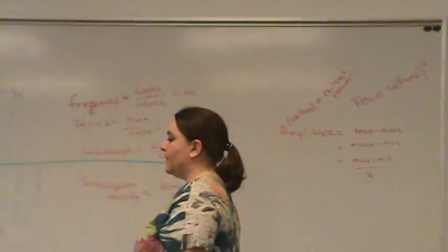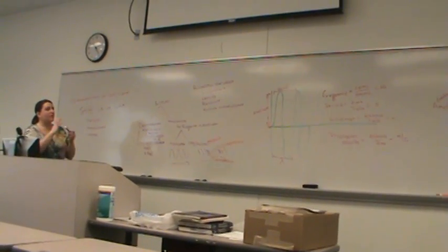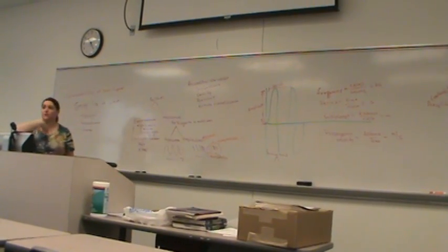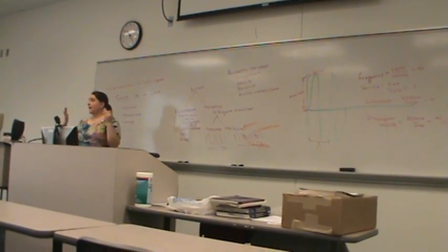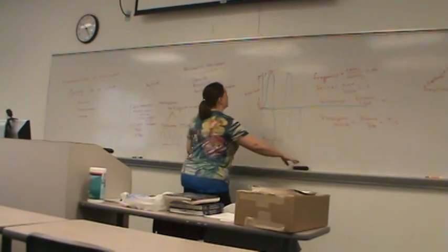Okay, so that was the basic idea of a wave, that we have this wave and it has all these different parameters to it. So any ultrasound wave has that. And if we were doing continuous wave, it's just going to continuously send all of this information out and continuously receive. But the downside of all of that is that it has no range resolution, right? I cannot tell how far away those pulses or the signal is coming from, the information that's coming back.